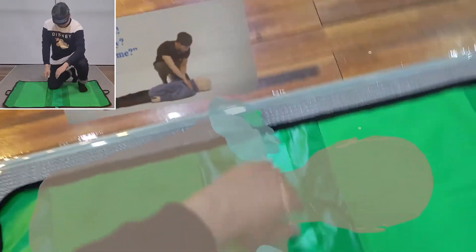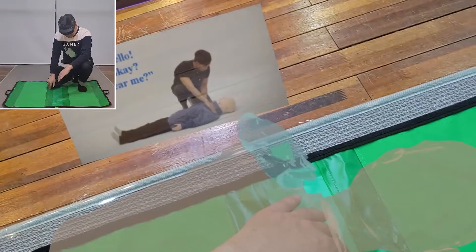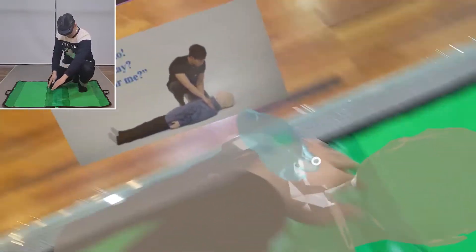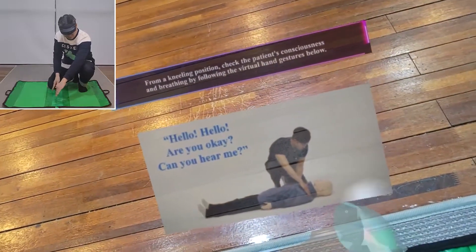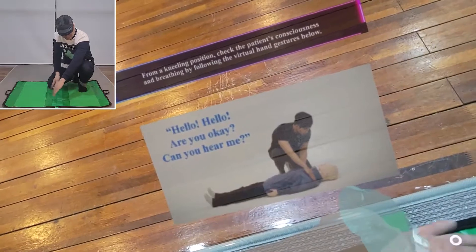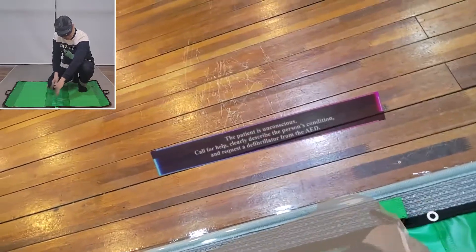From a kneeling position, check the patient's consciousness and breathing by following the virtual hand gestures below. Practice calling out: Hello? Hello? Are you okay? Can you hear me?